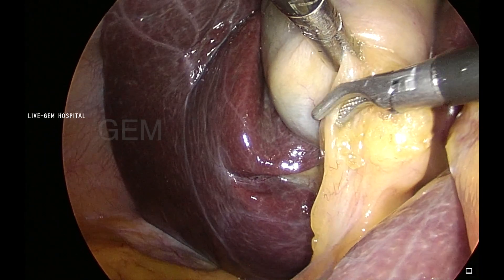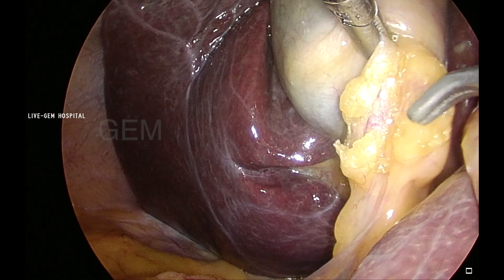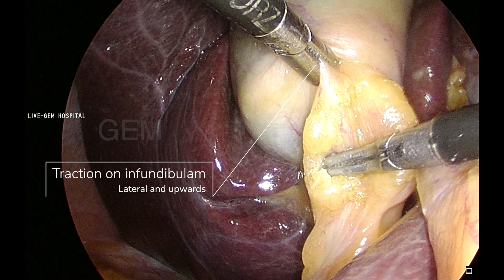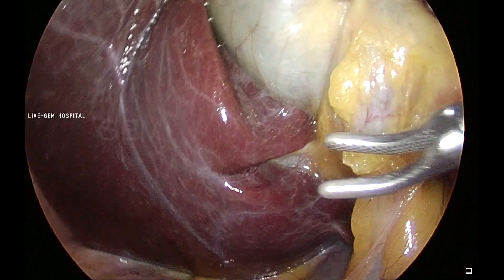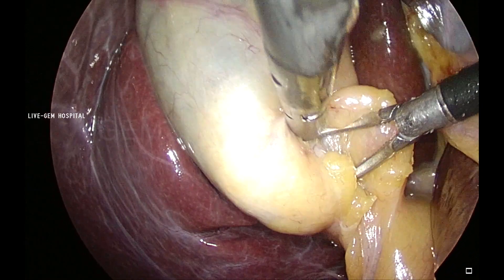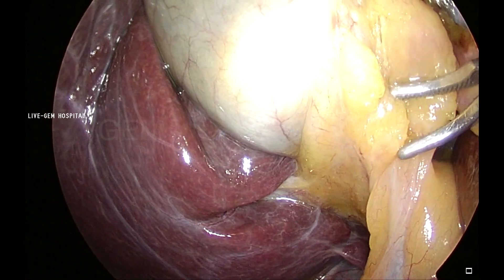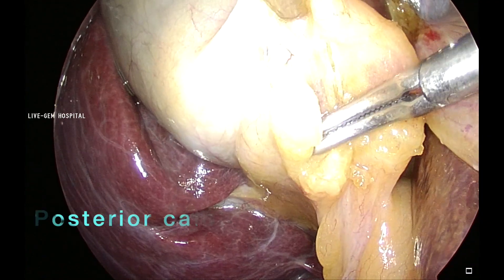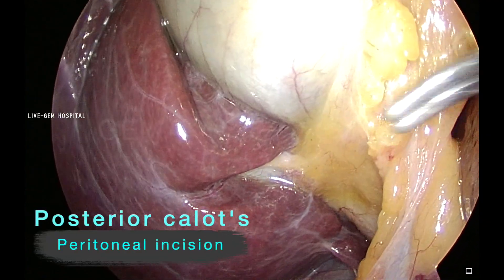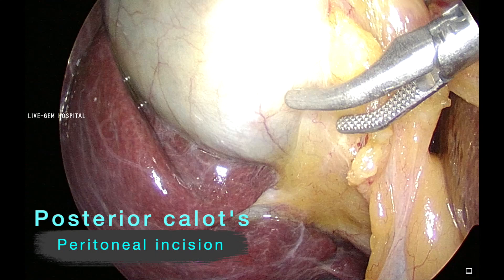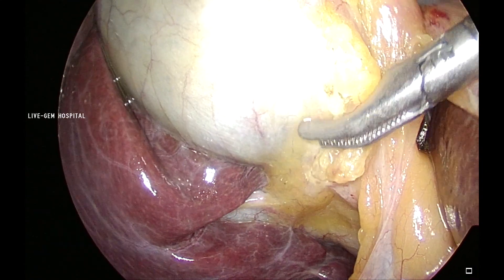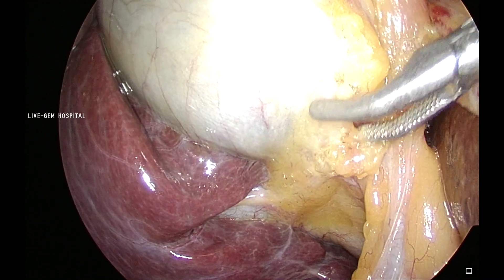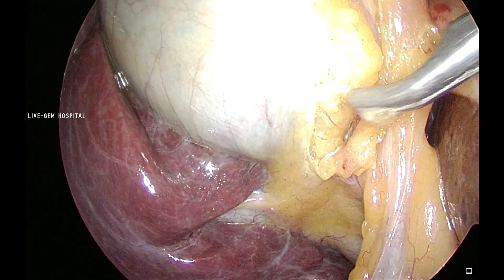You can also divide the entire falciform and the left lobe coming into view allows a little more traction compared with normal, or you can tilt the table right side up a little more. You can appreciate here I am changing the traction method of holding the infundibulum to expose the posterior peritoneum — the posterior Calot's peritoneum — and the liver surface is seen well with the right sectoral duct also visible. My aim is only to make the peritoneal incision.